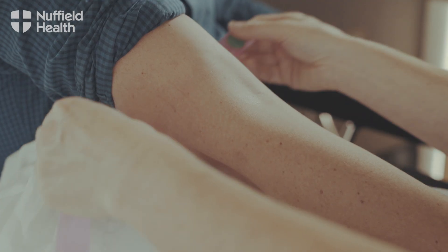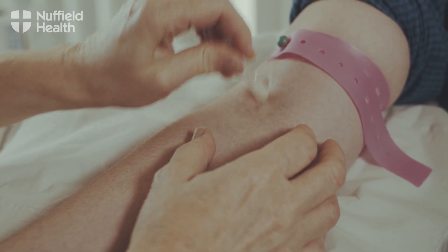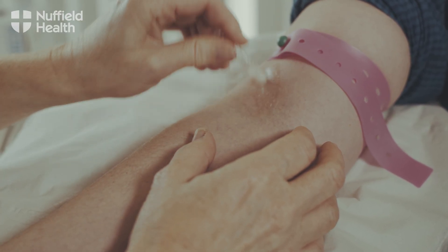But if we can't find anything that's easily accessible, we'll put a warming pad on for five to ten minutes just to make sure that the arm's nice and warm — it encourages the veins to come up a bit quicker. We then put the tourniquet on, we've identified the vein so we give it a good clean, 30 seconds with some chloroprep, and allow that to dry.